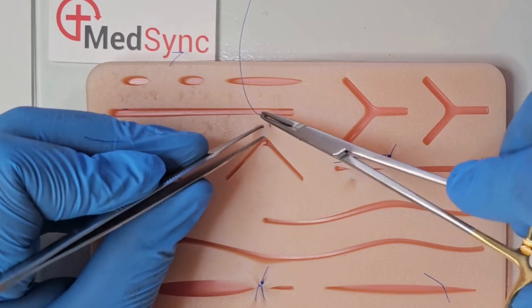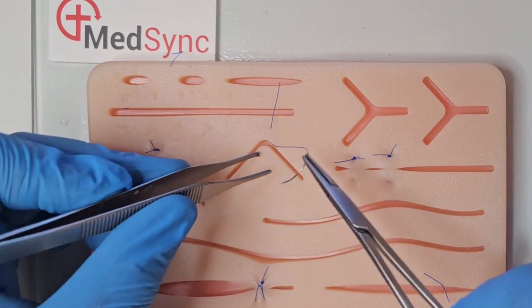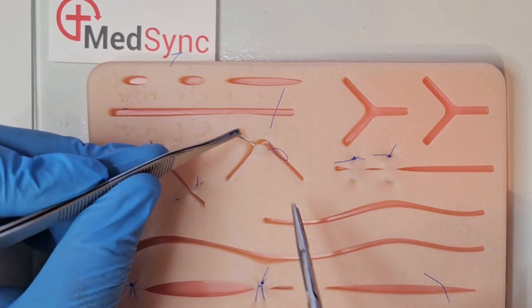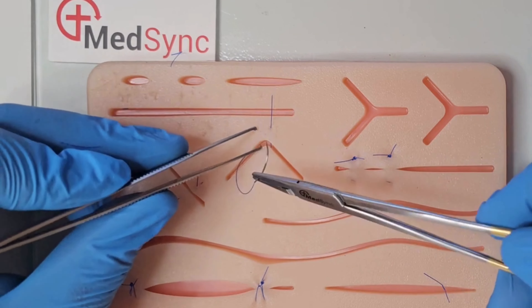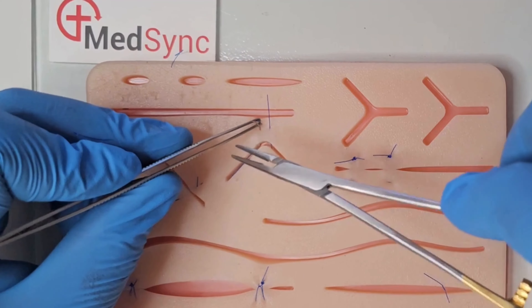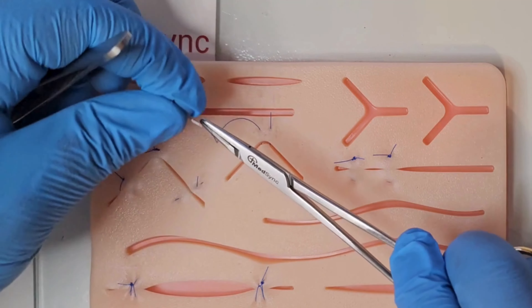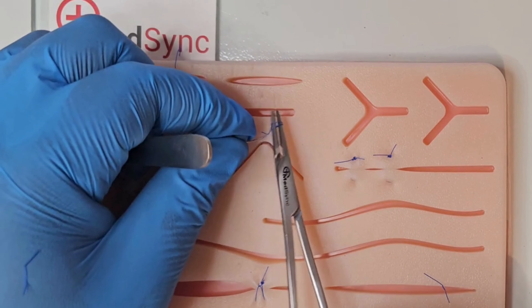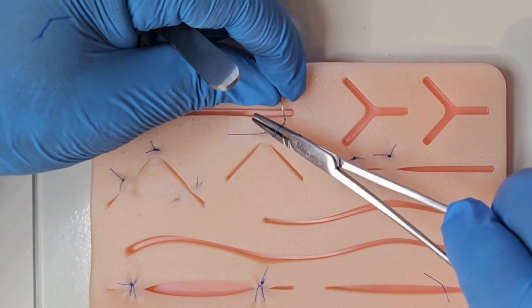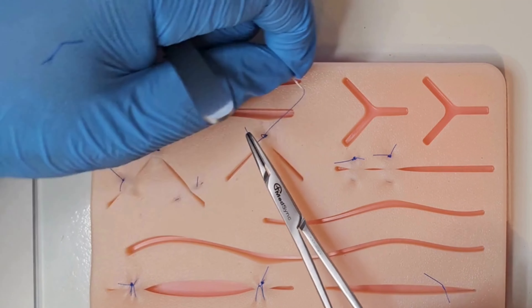You start as normal from outside to in, then take a transverse bite within the dermis. You do not want to see this suture in the epidermis from on top. Take the final bite exiting adjacent to the first, as with the final bite of a mattress suture. This is followed by your surgeon's knot, your reef knot, and another reef knot to secure your wound closure.